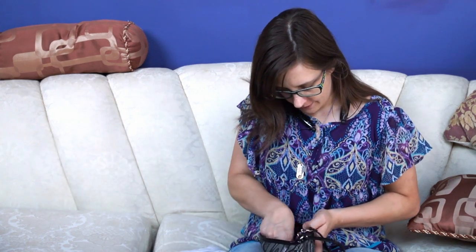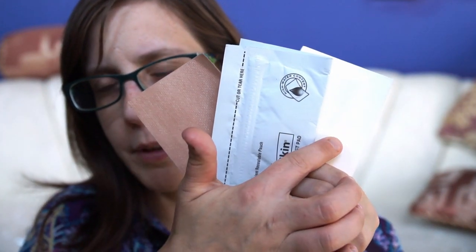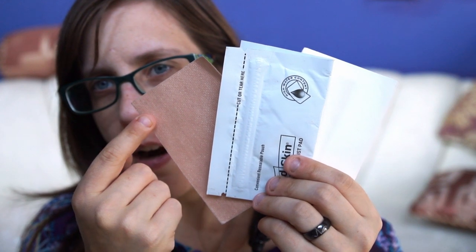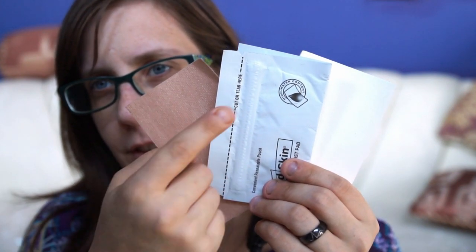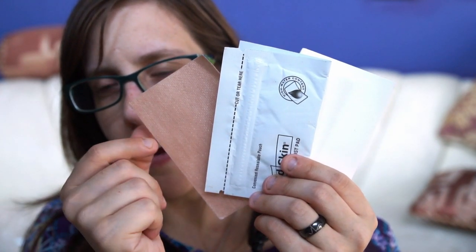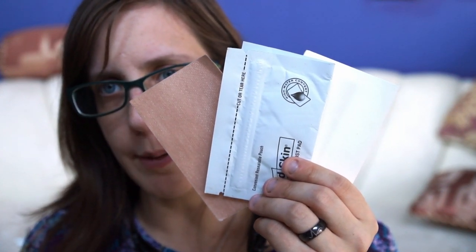Inside here, I've got a Second Skin Blister Kit. This kit comes with little blister pads that you can use to cover blisters, a square of adhesive-backed fabric that you can use to cover blisters, and a moisture pack. You put the moisture pack underneath either the blister pads or the fabric to help protect your blister if you were to get a blister on your residual limb.